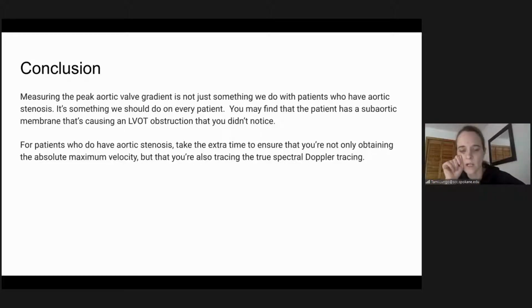This is just stating right here, it kind of protects your butt as a sonographer to always do a CW, I believe they're saying. Dropping a CW across the aorta.